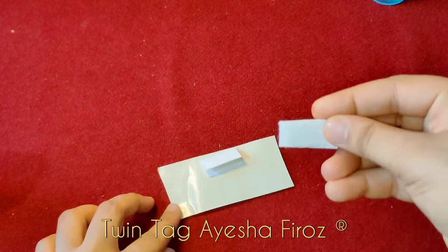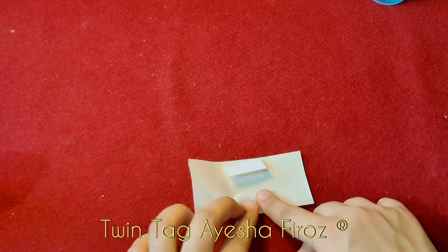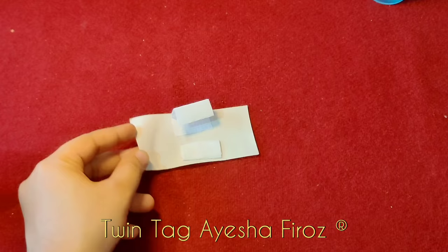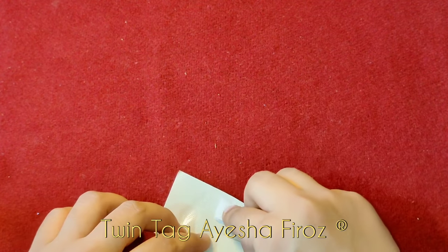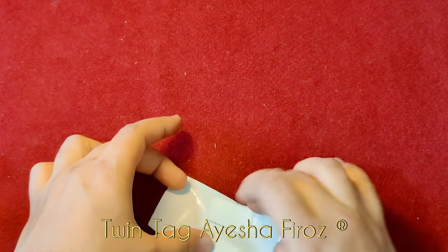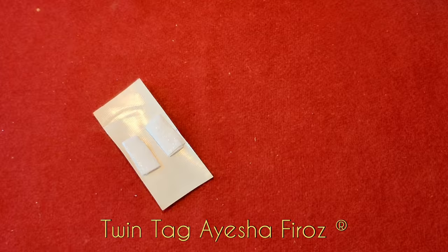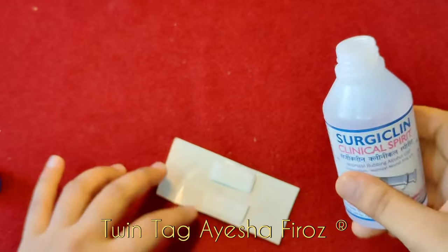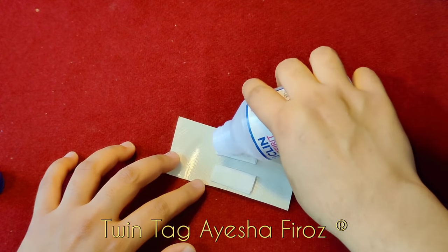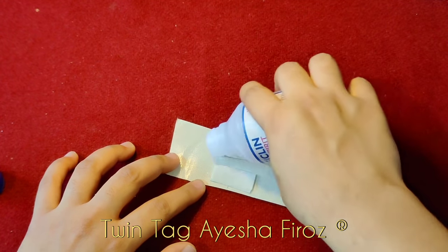I am going to stretch it and then stick it. Now I am going to use this surgical spirit — spread it and the two parts we will fold very well.